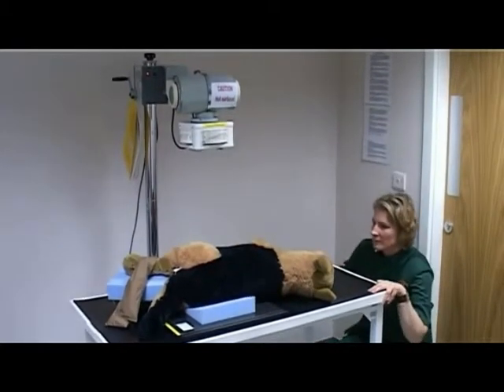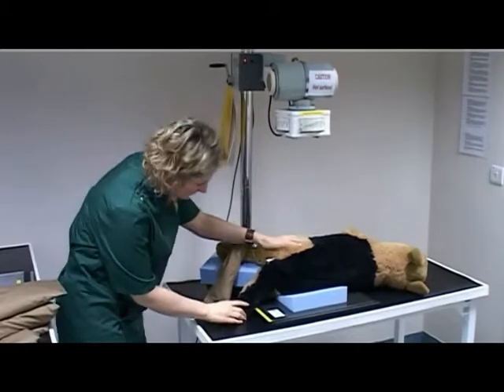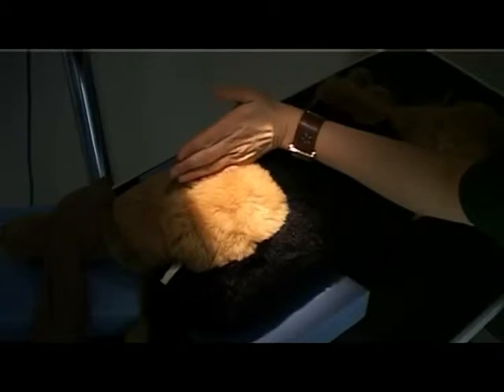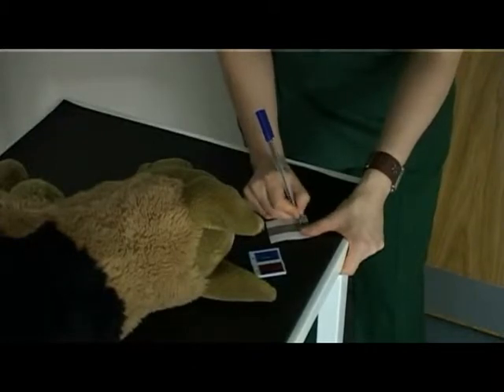Ensure that the lateral line of the patient is parallel to the cassette. Line up the tube head so that the primary beam is positioned over the lumbar spine region and within the edges of the cassette. Centre the primary beam over the mid-lumbar spine. Collimate caudally to include the greater trochanter, cranially to include the thoracolumbar junction, dorsally to include the skin surface, and ventrally to include the mid-abdomen. Label with the patient identification and date and place within the primary beam.